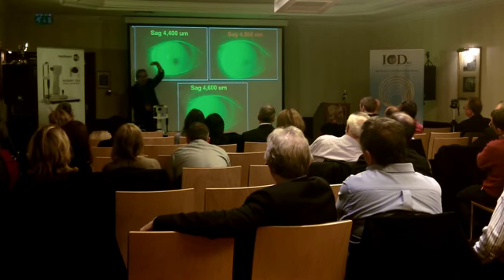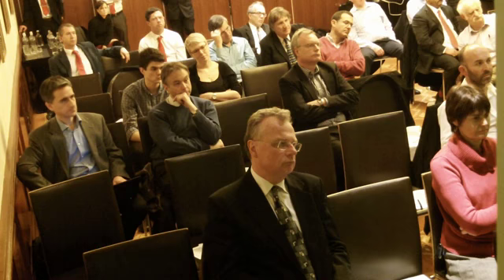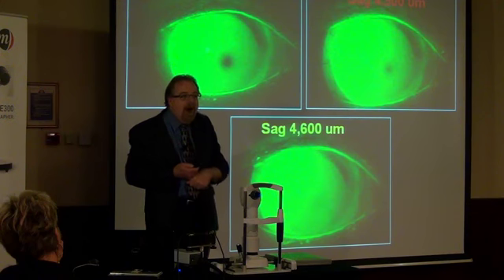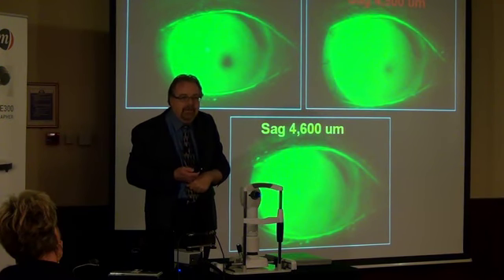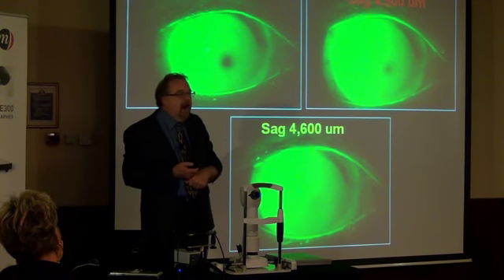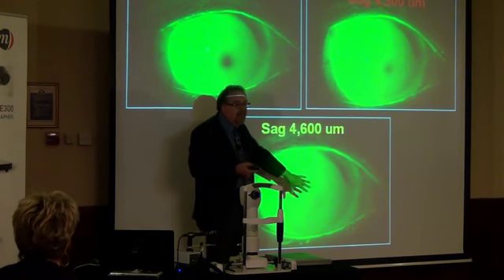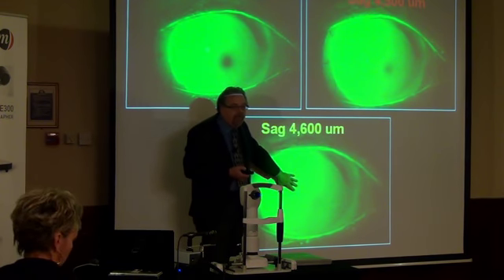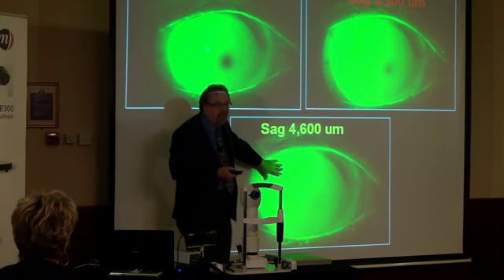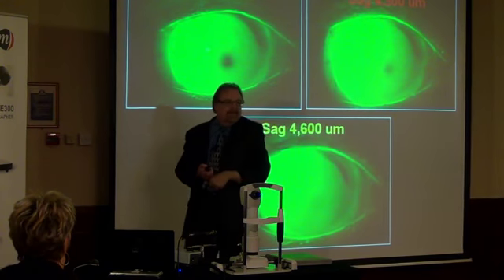4,600 microns in depth. Now, is that the contact lens I'm going to order? No. Why? I forgot something, didn't I? The lens hasn't settled. So I'm going to anticipate that after this lens drops 100 microns, what's it going to look like? You got it, right here. It's exactly what it's going to look like.